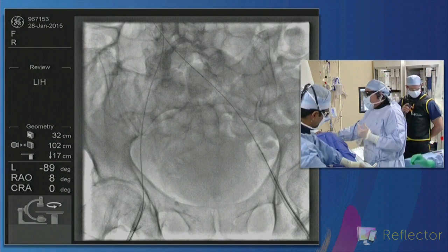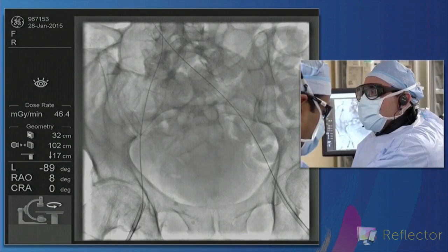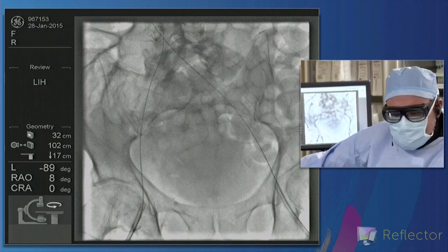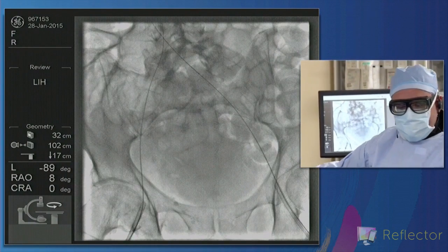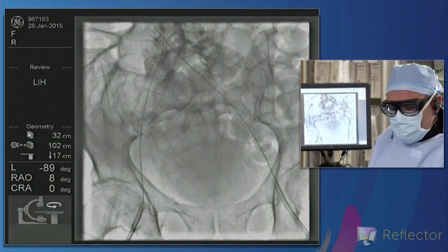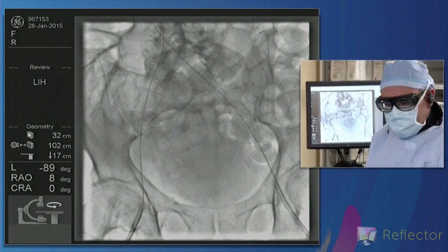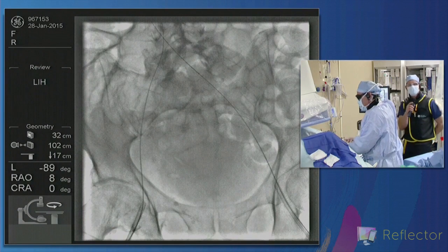Yes, absolutely. And you have to look at and really know the patient as well, because this patient has severe venous disease and stasis. Now, the one tricky part of this case is going to be pulling back the sheath enough to stent low enough in the external iliac, almost up to the common femoral vein. So I'm going to mark that now. So I believe this is a 16 millimeter wall stent, right? Yes, we're going to be using a 16 millimeter wall stent.